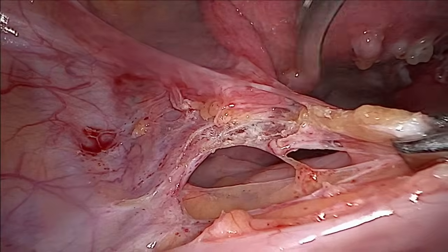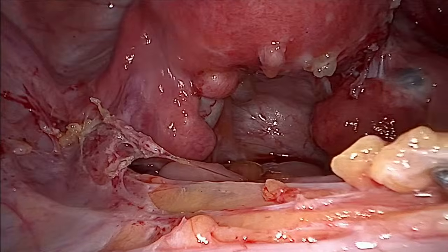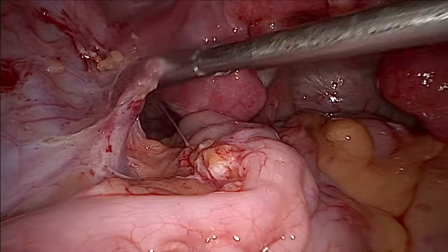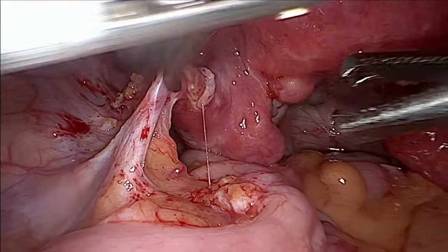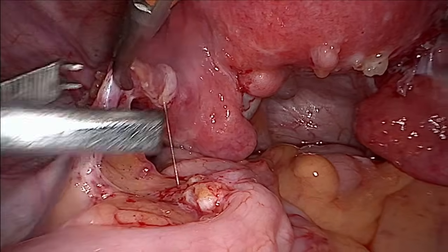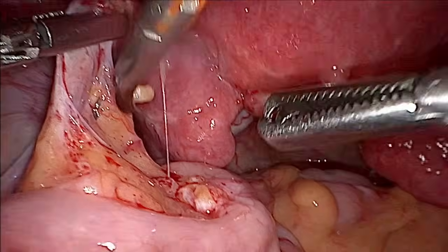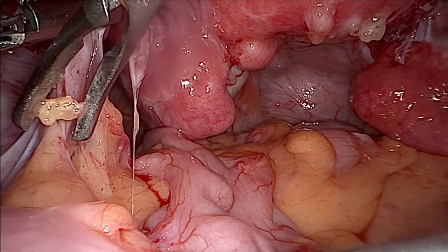You just go here. You remove this adhesion here, and there you go. Rasik is assisting me for this case. You can hold this, this is the IP ligament here. So now I can be parallel to the IP ligament.